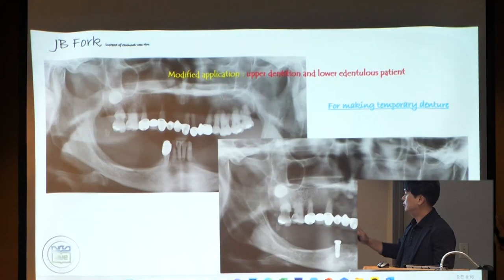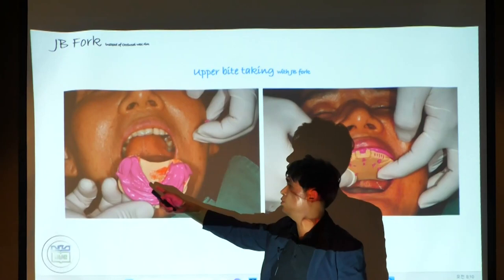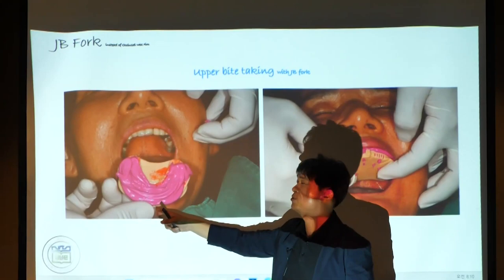After extraction, I insert the implant immediately. Then I put the JB upper plate with the bite silicone material, not the body. This only indicates the residual upper teeth. We don't necessarily need to connect the six teeth because he already has six teeth.